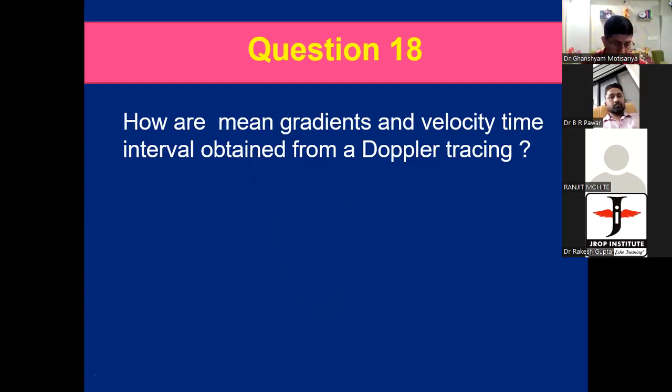Dr. Clay, is that fine? Before we go away, can you tell me, between pulse wave Doppler and continuous wave Doppler, which one is site specific?